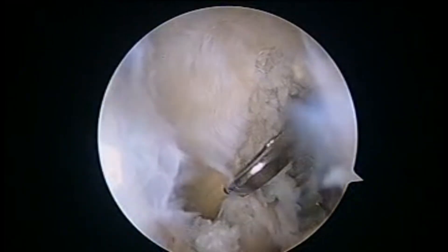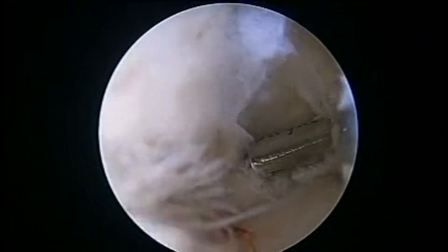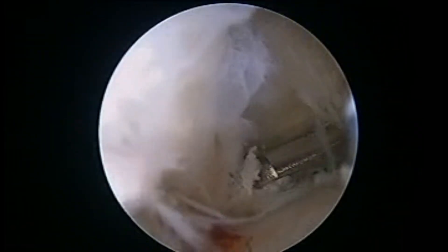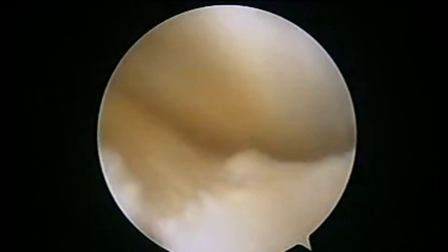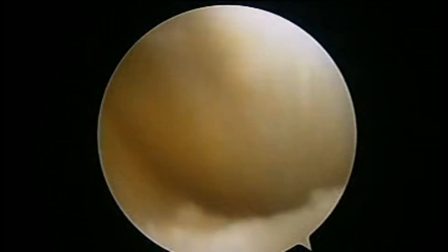We further debride the valve mechanism with the help of punch and shaver. On the posterior aspect, we see the bright shiny fibers of the medial head of gastrocnemius. The popliteal cyst is fully decompressed and all of its contents come out intra-articularly into the knee.